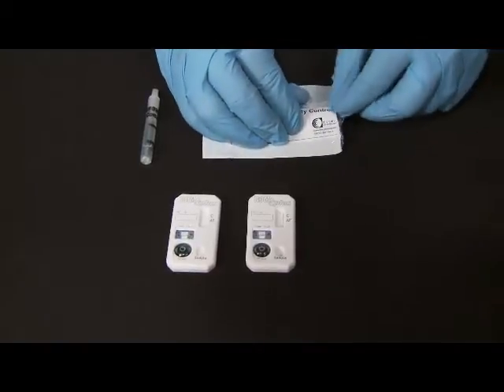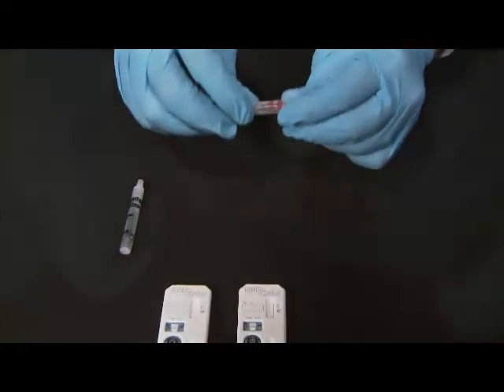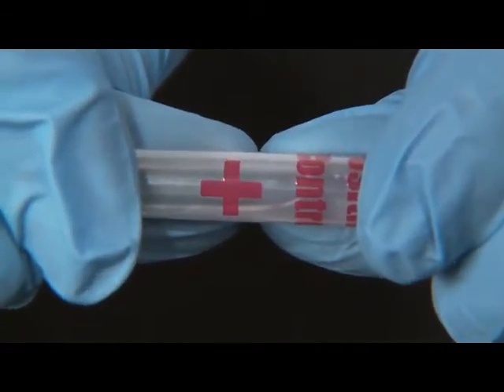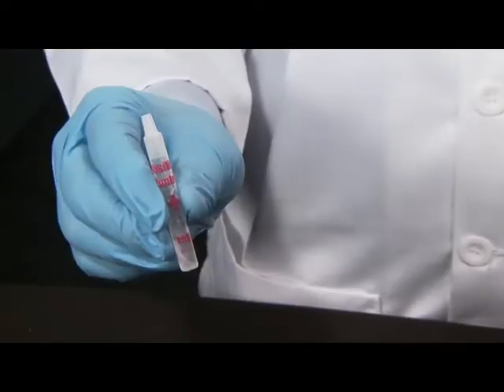Tear open the positive control vial foil pouch and remove the vial. Gently bend or squeeze the vial, breaking the glass ampule inside. Mix the buffer with the lyophilized positive sample until it is completely dissolved.